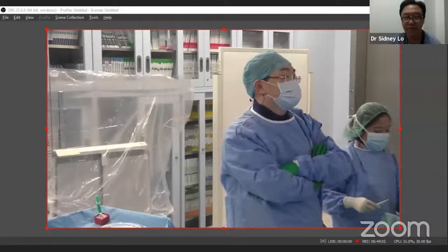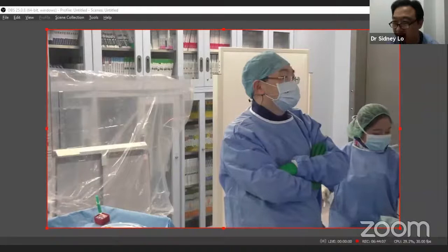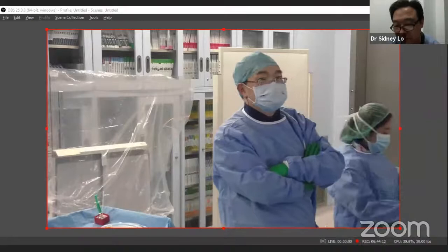And I agree with Dr. Takashi about, when you do post-dilatation, you want to look at the proximal and distal stent edge for edge dissection. And commonly, if you dissect it, you'll put a second short stent there. And then, of course, you look at the stent apposition and stent expansion.